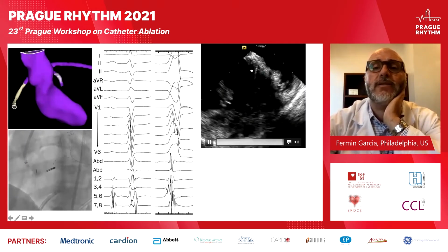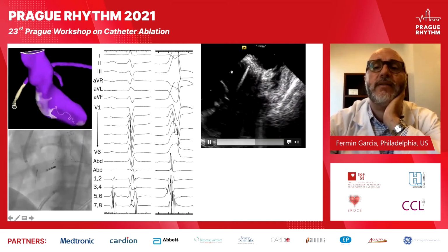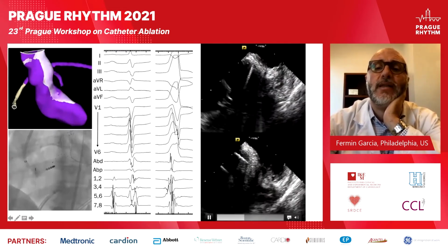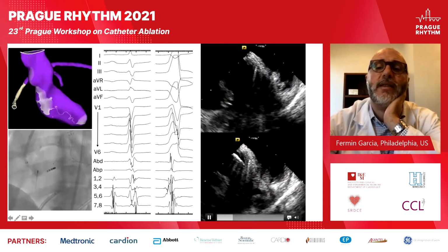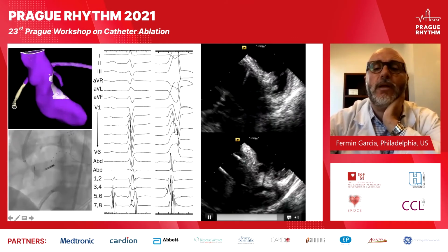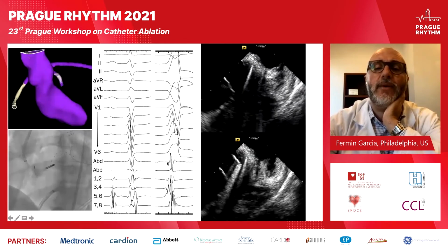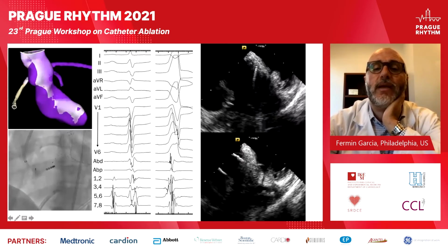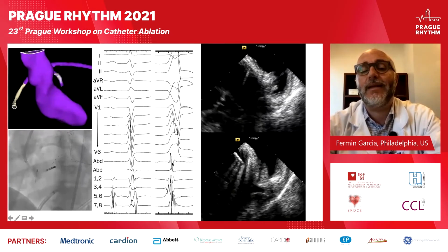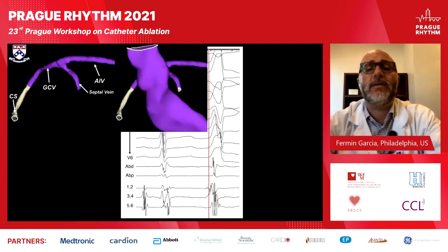I want to guide your attention to the location of the catheter in intracardiac echo. This is the RVOT, this is the LVOT, and this is the catheter tip in the septum. So we guide our ablation catheter and put it opposite to this area, and that's where we map. Okay, fluoroscopically, next to the first pole, in LVOT next to that bright area, and here we record a signal that is late compared to the duodeca catheter, sorry, to the octapolar catheter, and it's late in the endocardium. It's after the QRS. Would you ablate here? And do you think it would be successful?